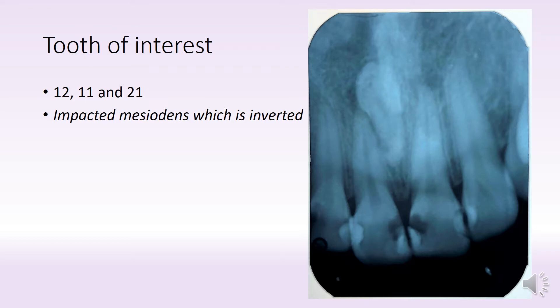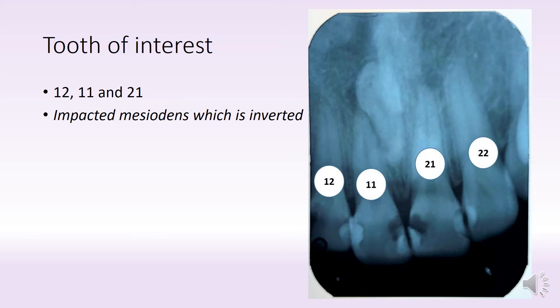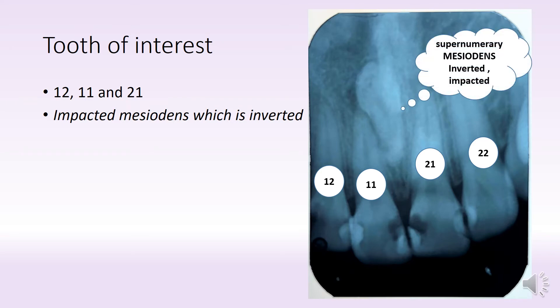The teeth of interest, or the area, is actually the maxillary anterior region. And what do we have here? We have the 1-2, 1-1, 2-1 and 2-2, and we also have an impacted tooth in the midline.